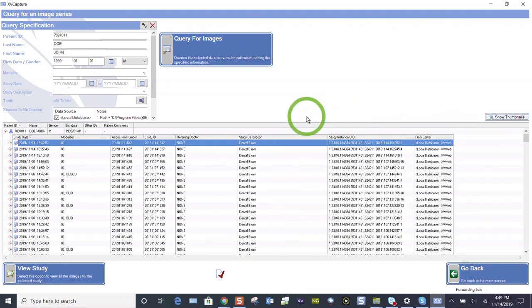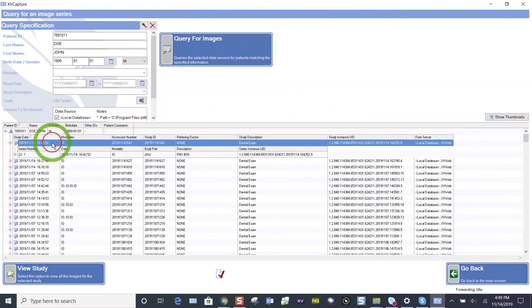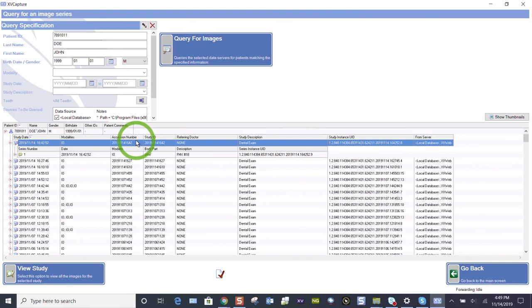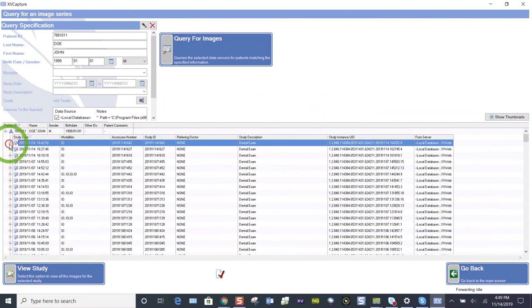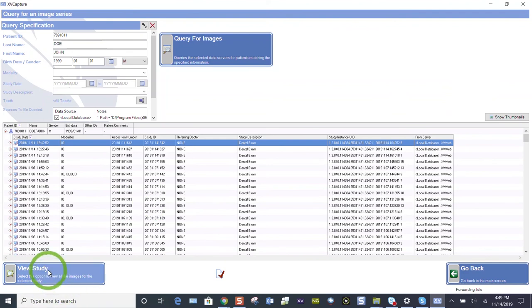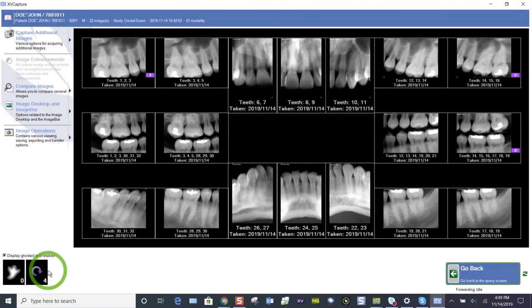So here's my FMX 18. I don't need those thumbnails. I know the date. I know the time. I can double click and it's going to tell me that that is an FMX 18. I can expand and collapse that. So whether you show the thumbnails or not, click on view study, and that's going to bring those images back up to where we were.